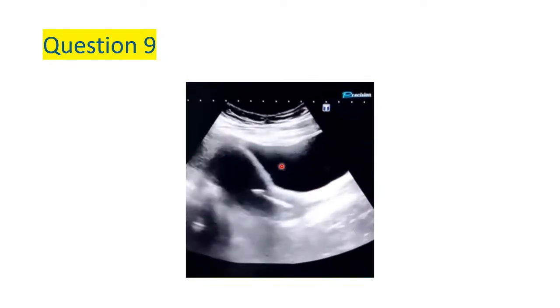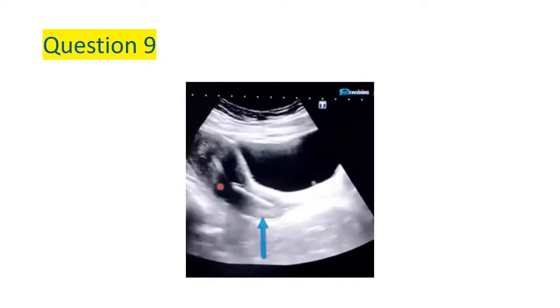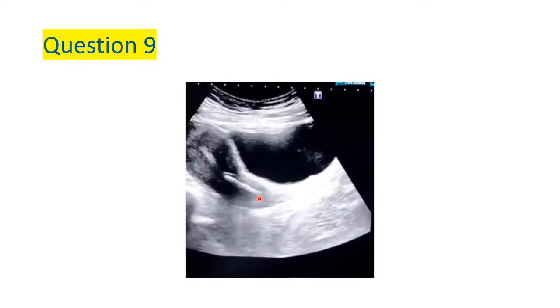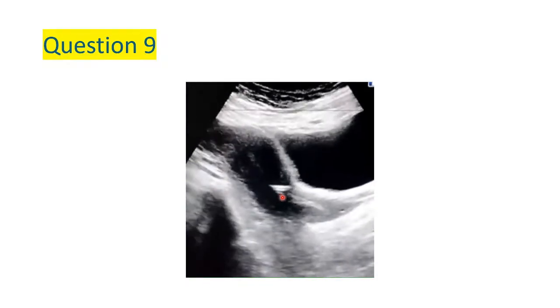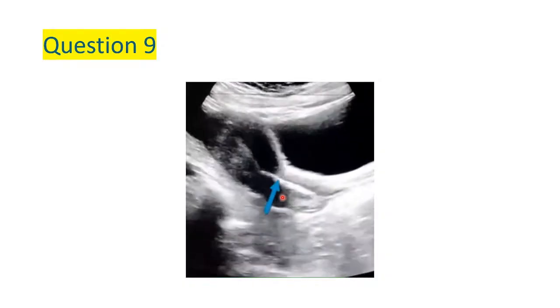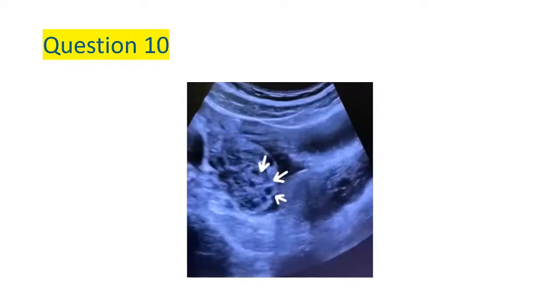That one is in keeping with a displaced device. It was supposed to be there in the endometrial cavity up there, but you can see it's in the endocervical canal. So this is a displaced IUCD located entirely in the cervix. So that's an IUCD that's misplaced or displaced.